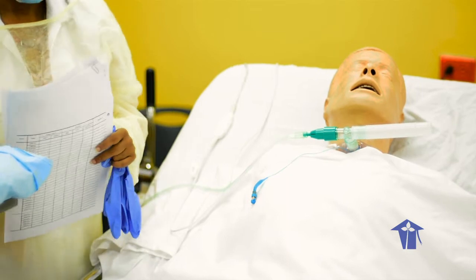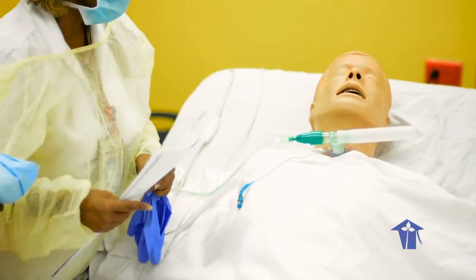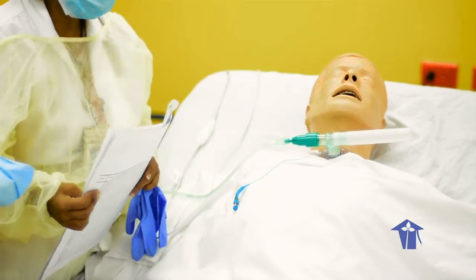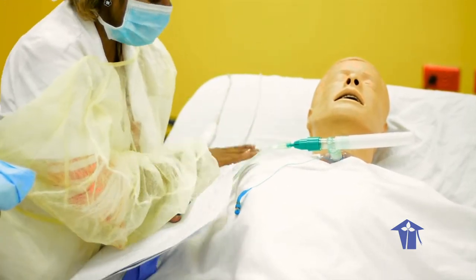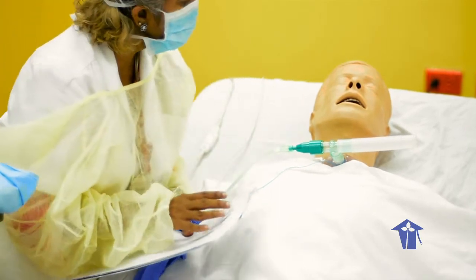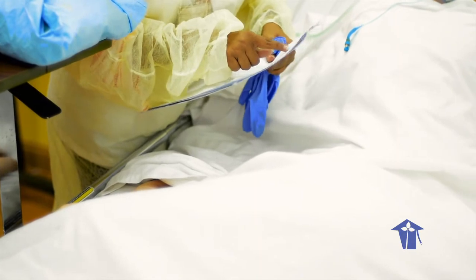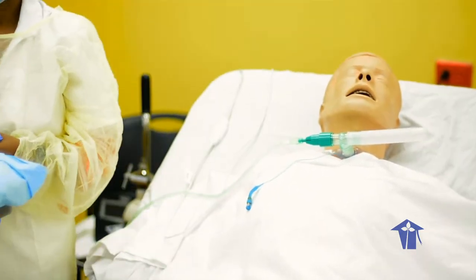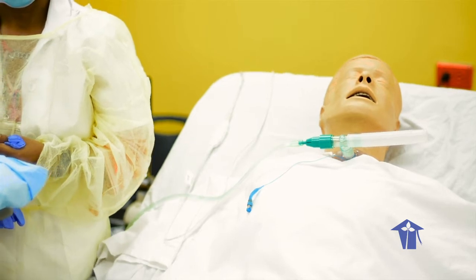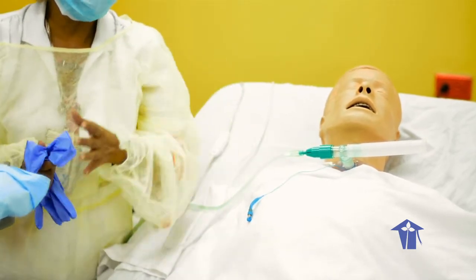Identify the patient. Good morning, sir. My name is Nurse Sant. I have come to do a cleaning of your tracheostomy, right? I just want to verify your name, so I'll have a look at your name tag, okay? So, Joe Black. All right, so we know we have the correct patient. Close curtain around bed and close doors. I've already screened your environment to provide you with some privacy, okay?